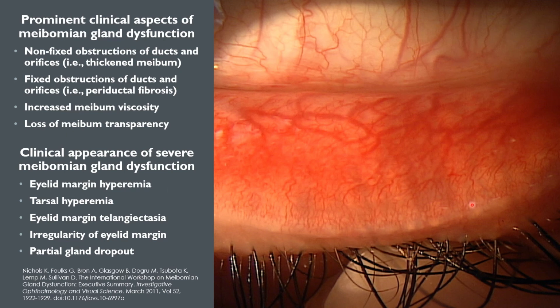You can see the glands. There's a gland right there, there's a gland right there, there's a gland right here. Look at this dark space. Here are the glands of atrophy. See right there where it's kind of dark? So gland, gland, gland, gland, gland, gland, no gland. Man, that would be 1,000 times easier to see on a meibography image. But we've got to start somewhere.